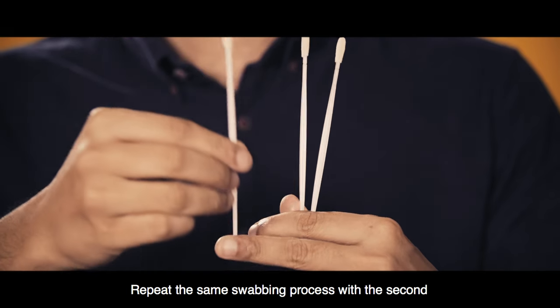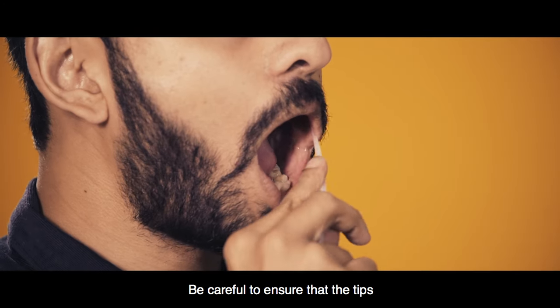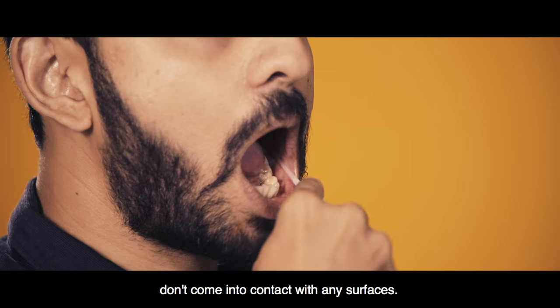Repeat the same swabbing process with the second and third stick for 60 seconds each. Be careful to ensure that the tips don't come into contact with any surfaces.